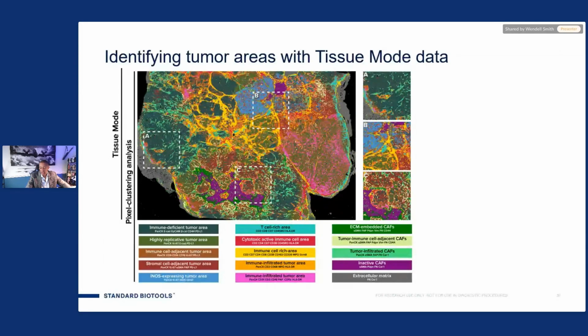Now, the advantage here is once you've done that, you simply click a button and say analyze. And when you analyze it, it generates a pseudomap of that image. It also generates percentage populations for phenotyping and the ratios in between, as well as nearest neighbor analysis. So it gives you a readout of a lot of information right off the bat in a matter of seconds to minutes. It's very fast. But if you want to take it further, we can change that to a CSV file, and you can put it into pretty much any platform you wish.